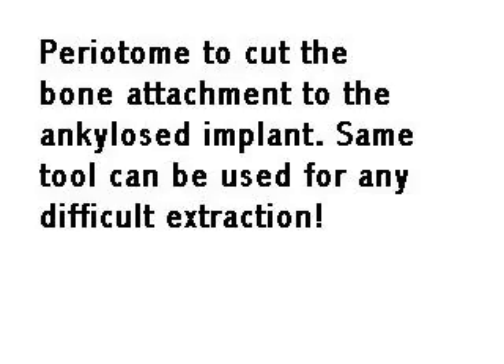The first step is to eliminate interproximal contact, to cut the bone that is ankylosed to the root. The tooth has two roots — a buccal and a lingual.